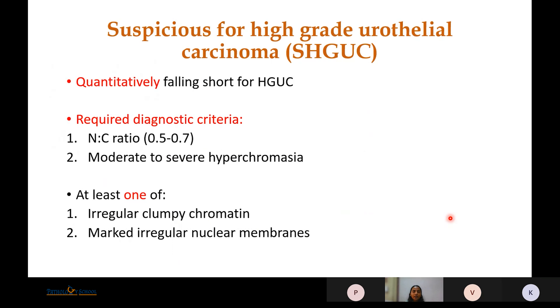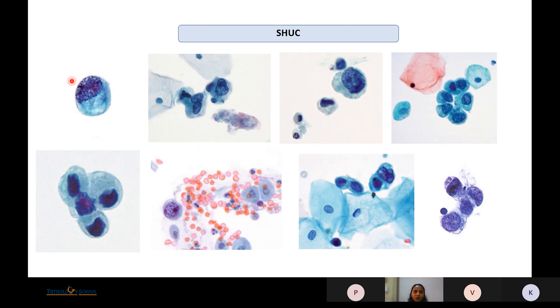The next category is Suspicious for High-Grade Urothelial Carcinoma — specimens that quantitatively fall short for high-grade. The required diagnostic criteria are a high NC ratio of 0.5 to 0.7 and moderate to severe hyperchromasia, plus at least one of: irregular clumped chromatin or markedly irregular nuclear membranes. Images show large cells with higher NC ratio and hyperchromasia, but these fall quantitatively short for high-grade urothelial carcinoma.